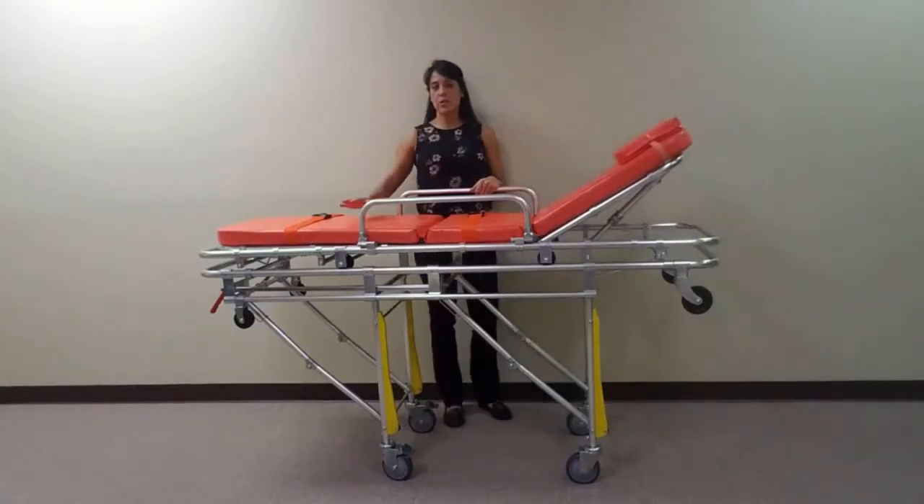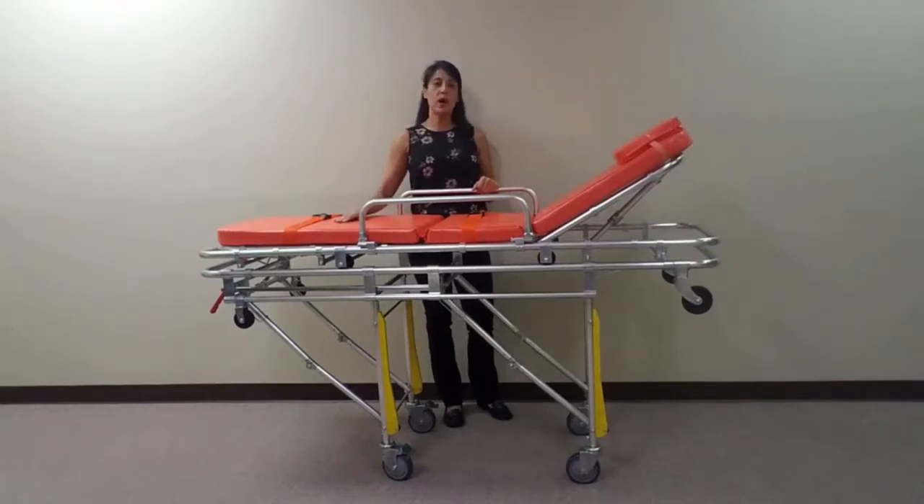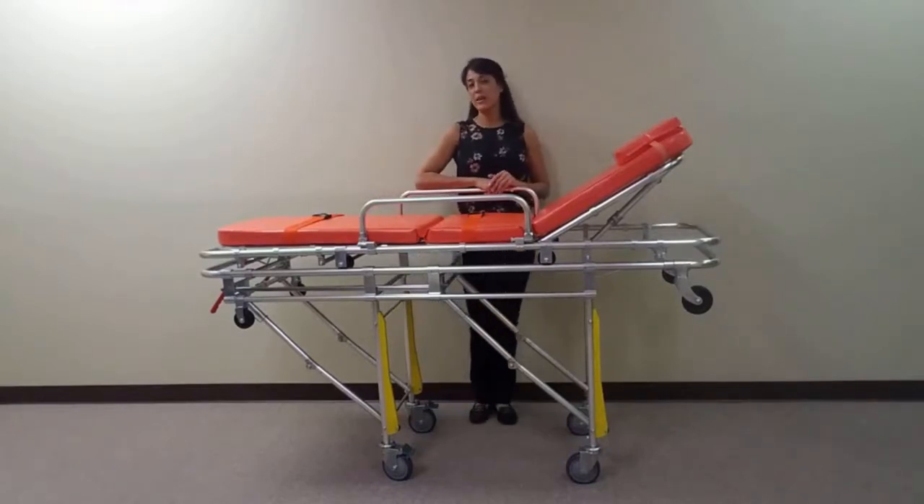This stretcher measures 39 inches to the top of the pad in its full upright position and 14 inches to the top of the pad when fully collapsed. The MS3C335 is made of aluminum alloy and has a weight capacity of 350 pounds. This unit comes standard with a one-year limited warranty.